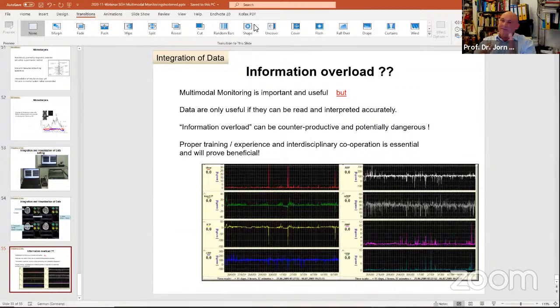So with my talk, I did not want to say that PO2 replaces ICP or anything. If you want to do monitoring, probably the first step is to start with ICP, because this is easy. And if you don't have an ICP probe, use a ventricular drain. That's why I said this. It's very easy. This is the easiest way of reducing the ICP, because if people have ventricles in the scan, put a drain in.